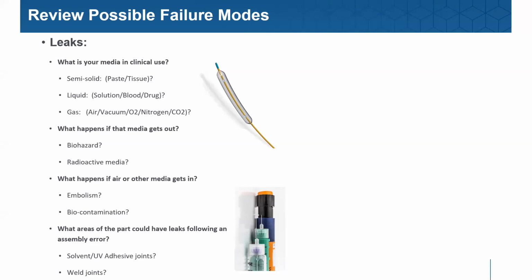Now, we love those because the balloon is very rigid. If it's deflated and you felt it in your fingers, it's actually kind of crunchy. The balloon material is very rigid because it's designed to only expand to a certain diameter, even when pressurized at extremely high liquid or hydrostatic pressures.